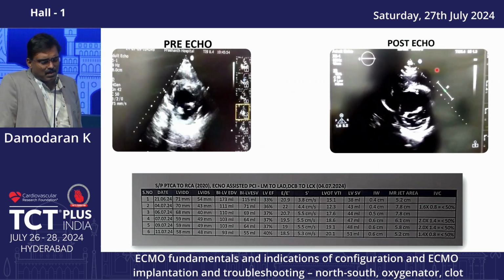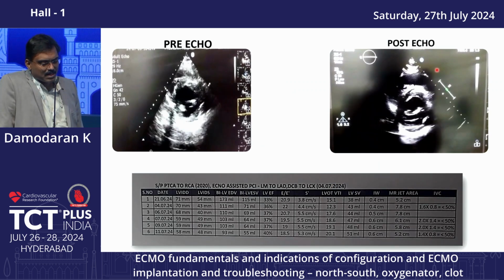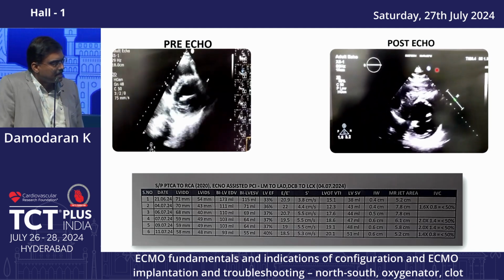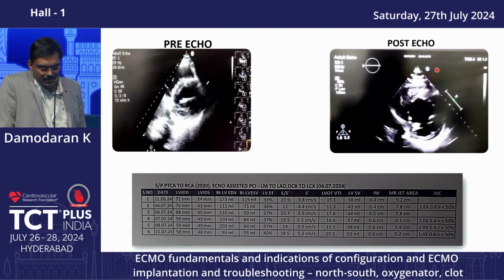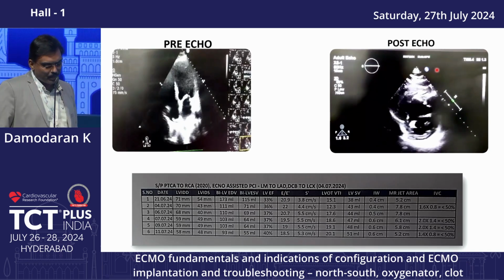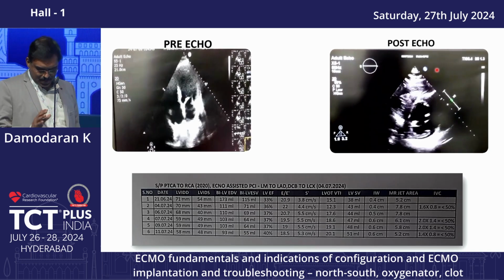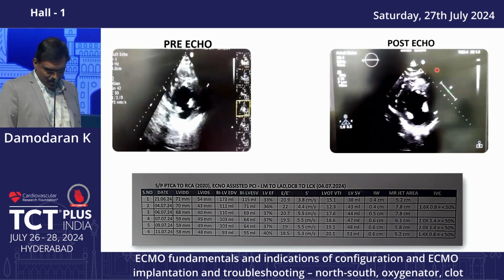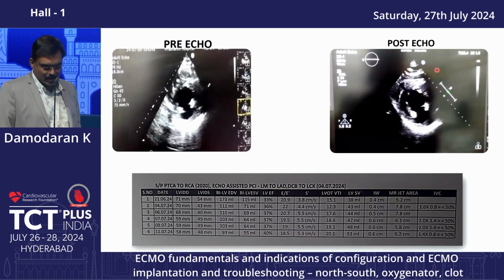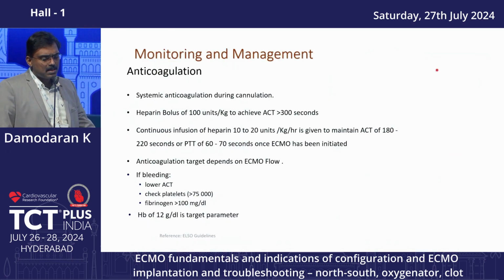So though there is not much improvement in LVEF, which can happen in a week's time, I could understand one thing, the LVOT VTI has much improved. You can see the LVOT VTI shows there is some improvement in stroke volume. And the patient was managed in the ICU 2-3 days with some diuretics and dobutamine, minimal support, and he became well.